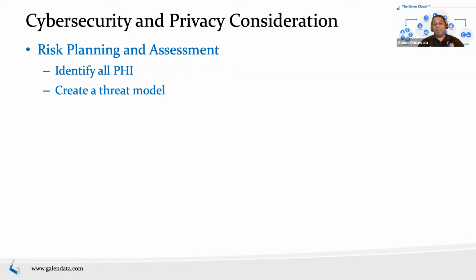All of that goes within a comprehensive risk assessment, essentially called a threat model. This is something the FDA, if the draft guidance of 2022 becomes required, will make essential. And the draft guidance is draft, but don't get fooled by the name draft. It's essentially the current thinking of the FDA. So they're already requiring some higher risk devices to provide a threat model. This is something that will become more and more required for other categories of devices as well.